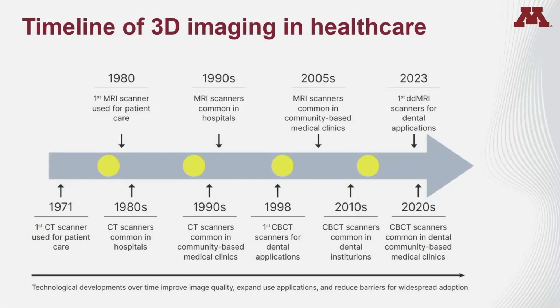And so the part that I'm really excited to talk to you guys about is the development of an MRI scanner that's being designed and made specifically to address dental practice. And this is just a schematic outlining cone beam CT as it's gone over time on the bottom. And we're very familiar with cone beam CT coming to the dental audience. And so what industries looked at is this lag, and they're like, hey, it looks like it's time for MRI from a dental perspective now.